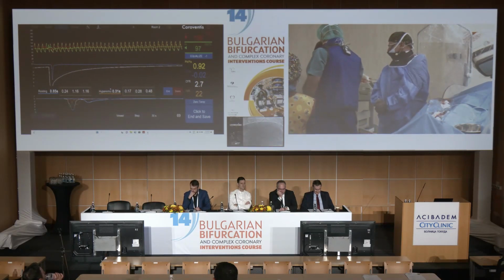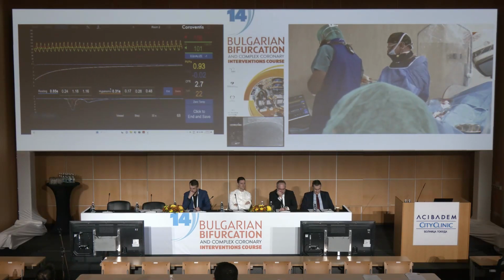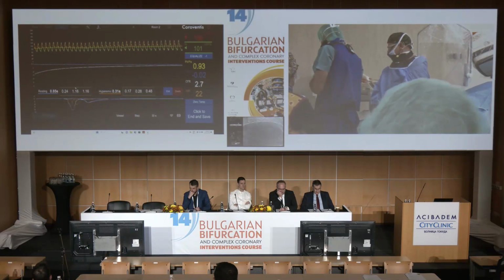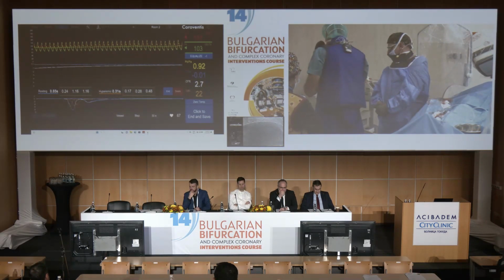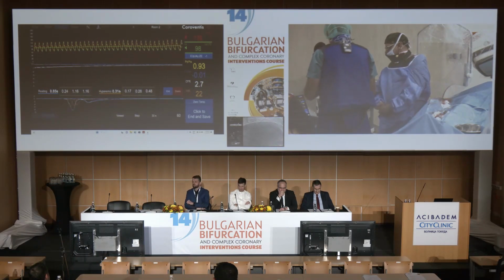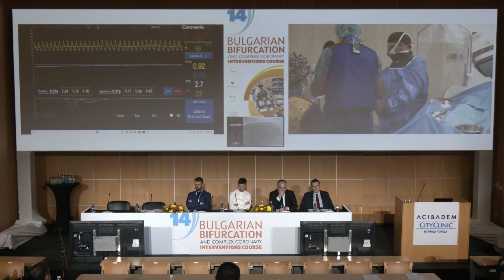Now, please do not pay attention to the changes in values that we have seen, but actually to obtain a coronary flow reserve, we have to divide these times by these times. We made a couple of small mistakes by not being well synchronized, Valérie.